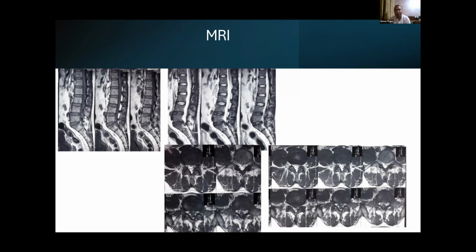Yeah, obviously there will be a large fragment. So we should not be happy just by removing one fragment, because there are still many fragments that need to be removed. So recheck and recheck is mandatory for a complete decompression.